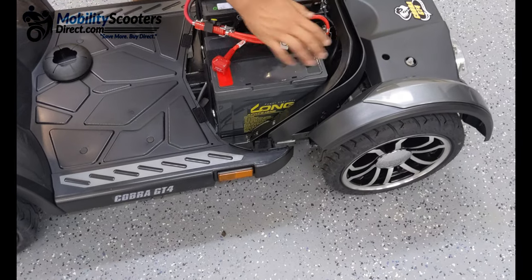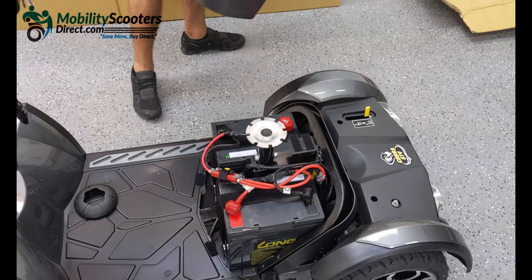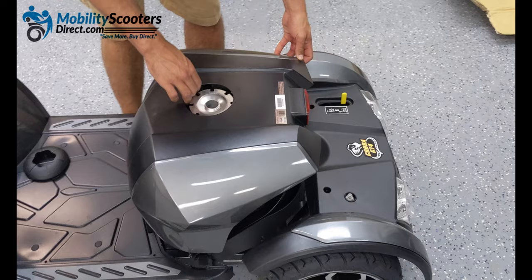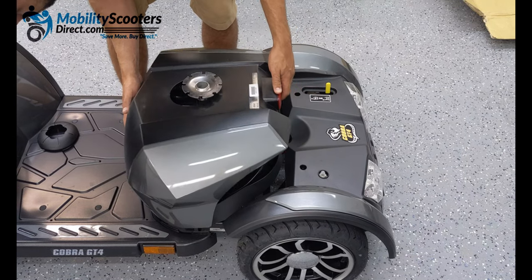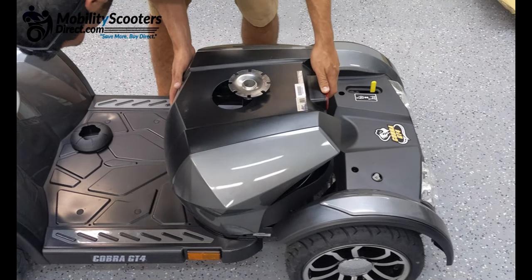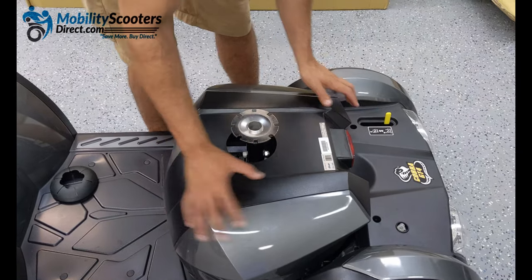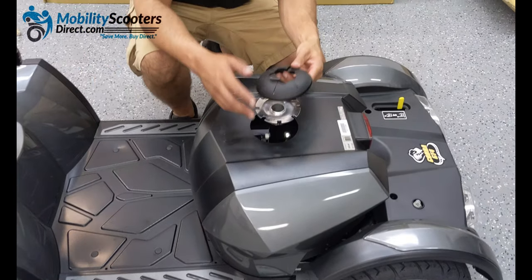To reattach the shroud cover, start with the two tabs towards the front on the floorboard. Make sure that they're resting right in the little slots that they belong in, and then work on the back part of the shroud cover by pushing it down, making sure not to let the seat post scratch any of the shroud covering itself. Then simply put the grommet right over the post and reattach it.